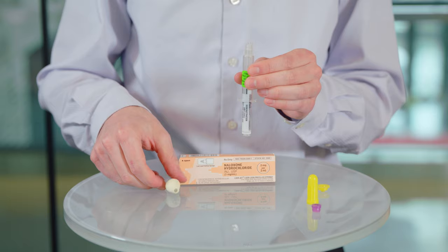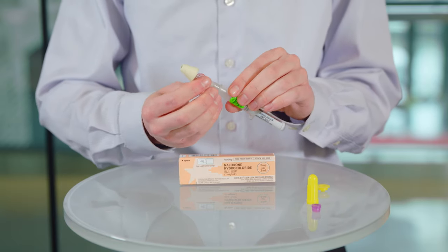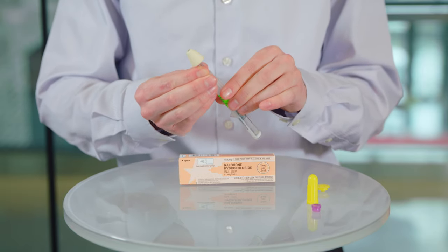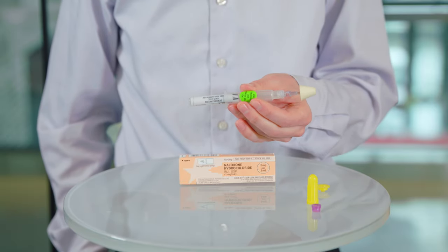Finally, take the nasal atomizer out of its package and twist it onto the end of the syringe until you meet resistance. The atomizer is important because it helps spray the drug into the nose. Now your dose of intranasal naloxone is ready to administer.